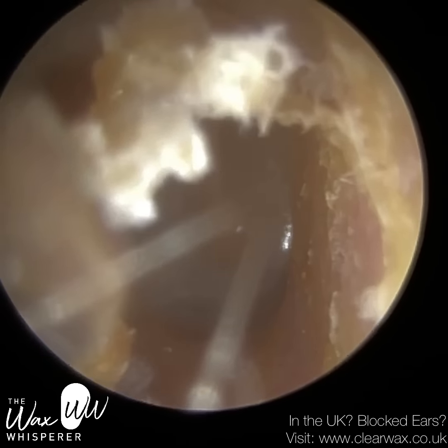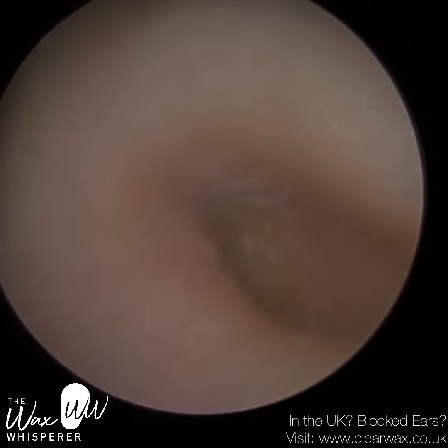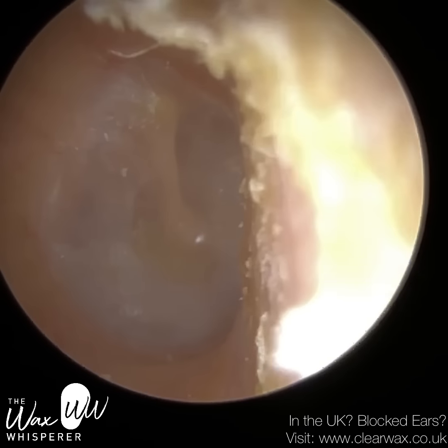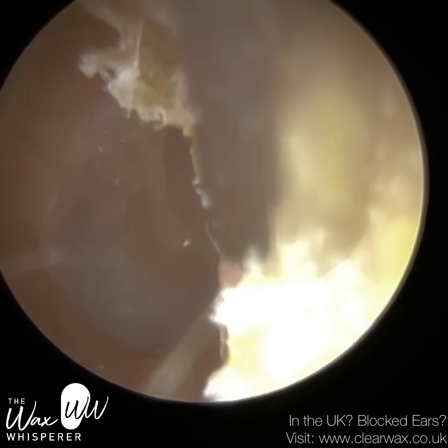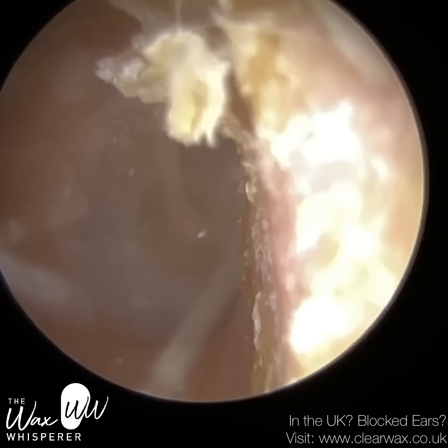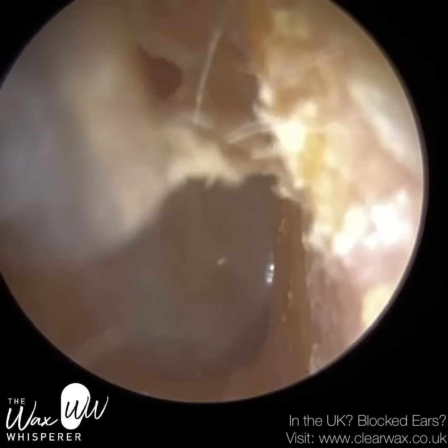And what that does, it stretches open the ear canal and it straightens it. And by doing that, I can then insert the instrument into the ear. So you can see I've stretched the ear open, pushing it to the left, and I can go into the ear with the sucker seal. This time I didn't stretch it as much because I'm working on the front part of the ear canal.